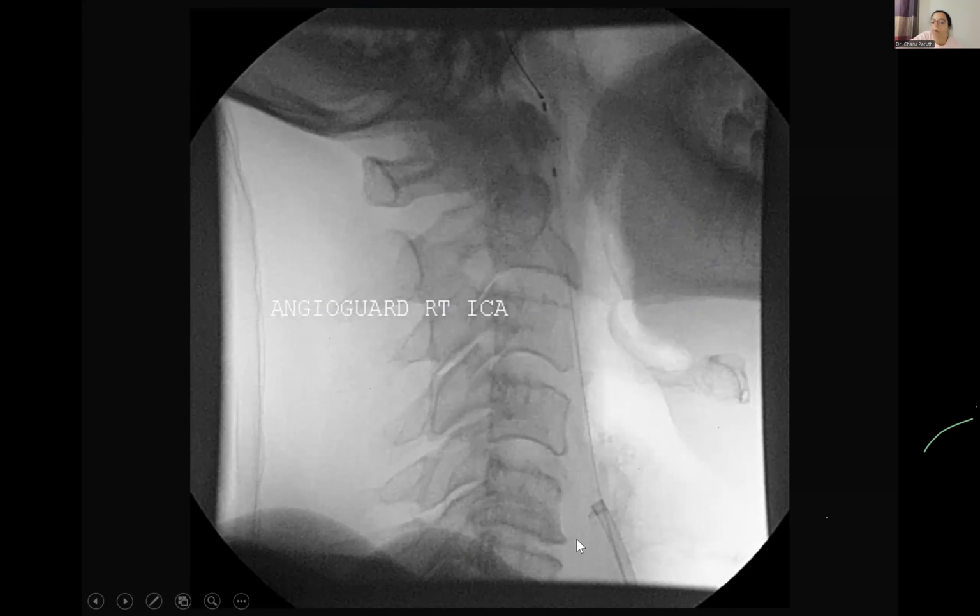We also have proximal embolic protection devices if you're not able to navigate beyond the obstruction. Therein we apply a negative suction pressure proximally so that all the clots or the fragmented plaque come proximally. But this is usually placed in a straight segment of the distal cervical ICA.